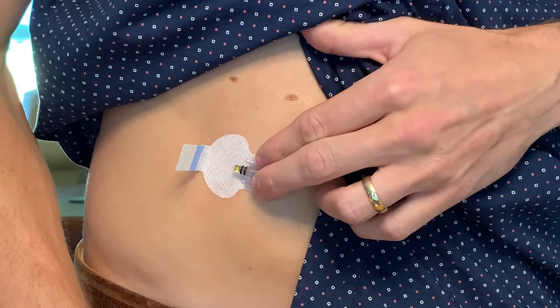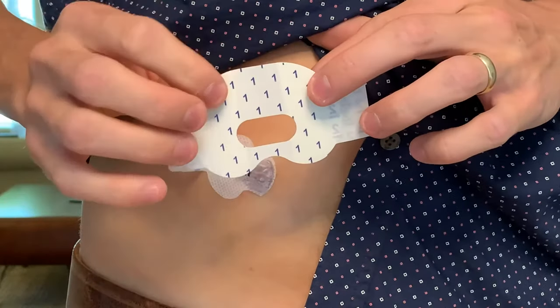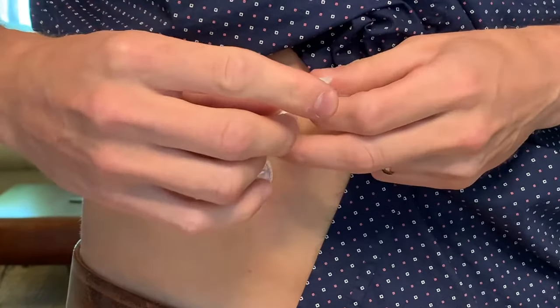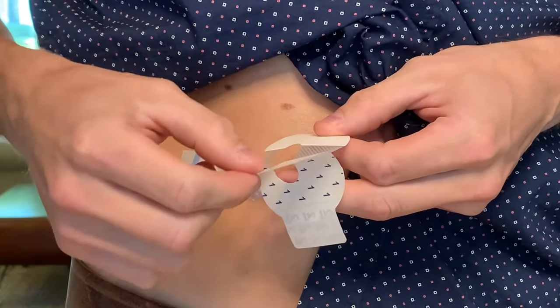Next comes applying the first piece of oval tape to keep the sensor secure. You can see that there's a number one and number two on the paper liners. First, I'll take off the paper liner with number one, but won't take off the liner with number two just yet.